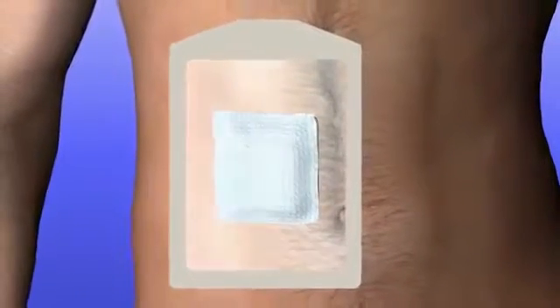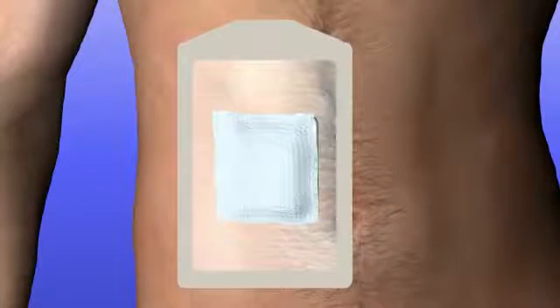Peel the dressing from the printed paper backing, exposing the adhesive surface. View the area where the dressing is to be applied through the film and center the dressing over the wound. Press it down. Do not stretch the dressing during the application.